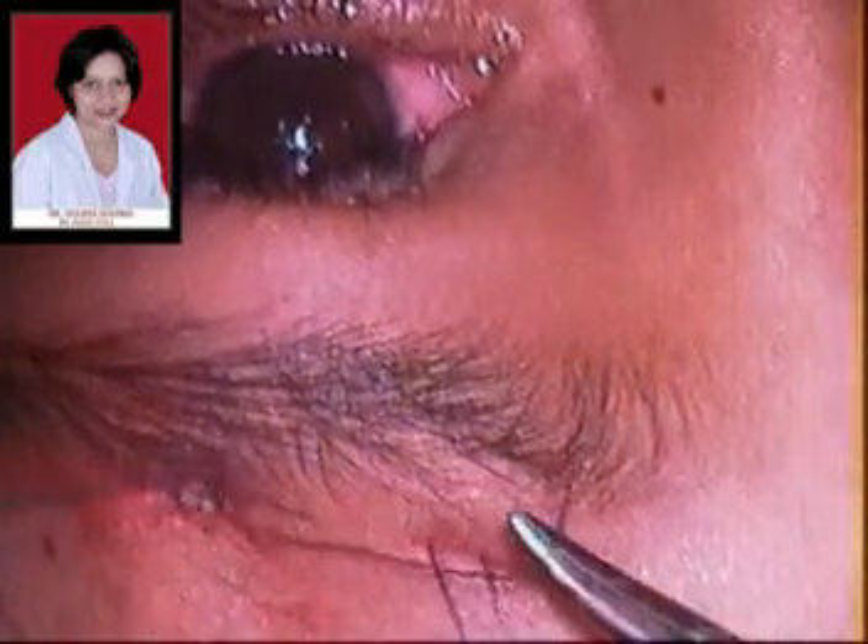We check the lid contour by adjusting the tension on these two triangles so that the lid contour is good. The lid contour is extremely important in cases of ptosis and sometimes it may even be more important than the actual height of the eyelid achieved, as a good correction with a poor lid contour will give a very unpleasant or displeasing appearance to the eyelid.